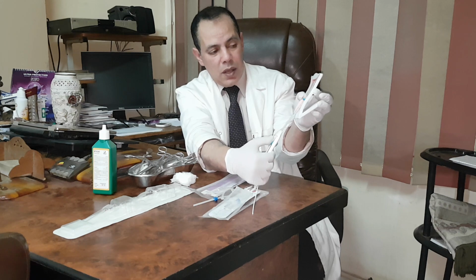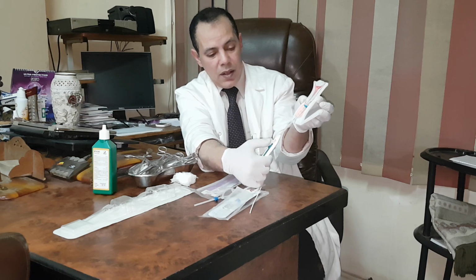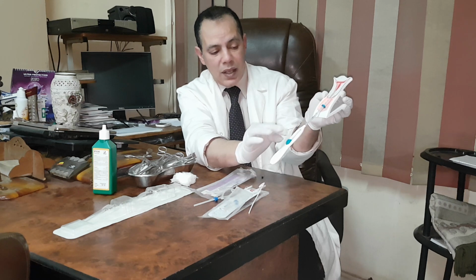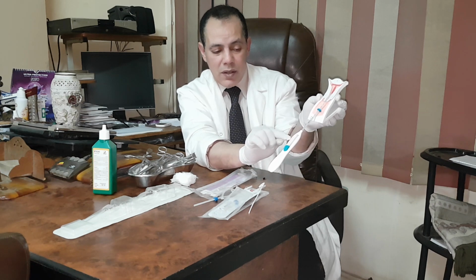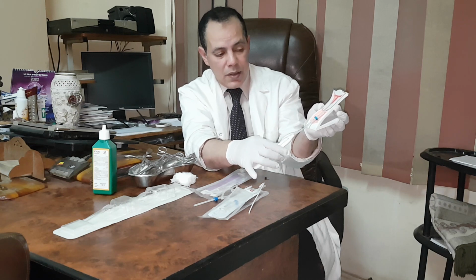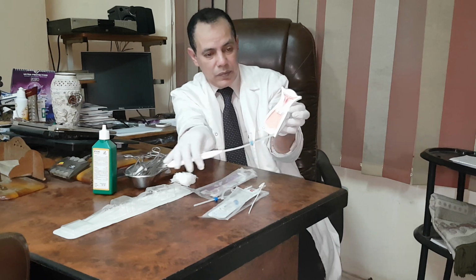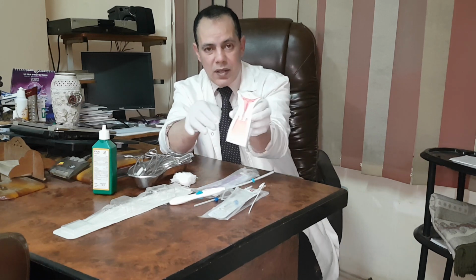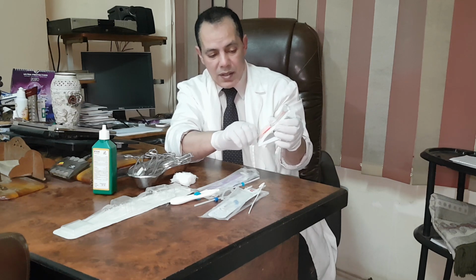Now the IUD is inside. A little push forward, then complete by pushing down to the next mark. So I have two grades. The first grade releases the transverse arms, the second grade releases the whole IUD. Then withdraw, as you see, like that. So the IUD is now inside. Then I cut the threads as usual, as with the previous IUD.